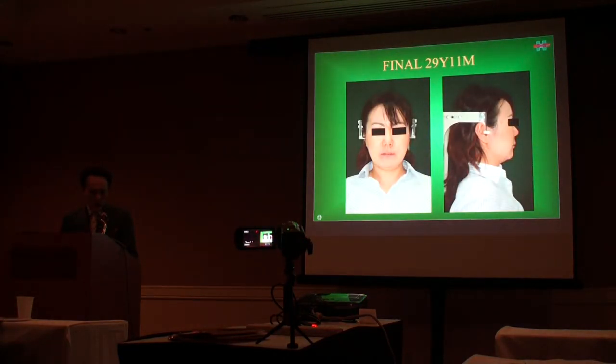The active treatment ended in 24 months. A headgear was applied to the patient 3 months after the braces had been onset. The frontal view of the face shows an improved lip contour without orbicularis oris strain. A well-balanced, pleasing facial profile was obtained, for the lips were retracted and also the strain of the mental region was gone because the protrusion of the anterior teeth was improved.